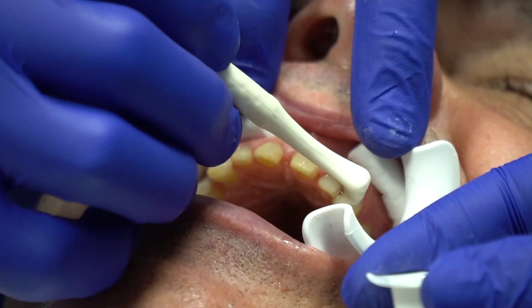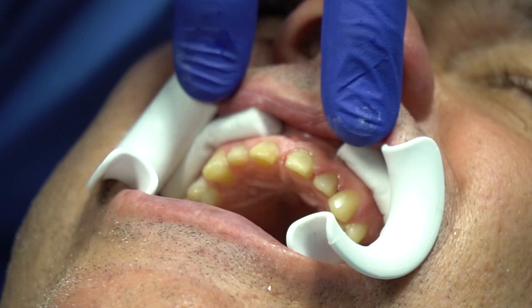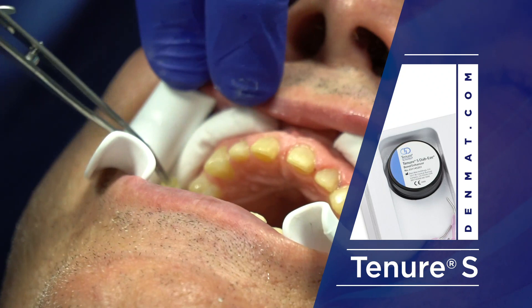I use the saliva ejector from a distance — not up close. Now we've got a pretty glossy surface with only two coats. We're going to use the Tenure S next. The Tenure S goes in to cover the bonding surface, and now Joanna's going to start loading up each of the veneers and we'll just pop them on.